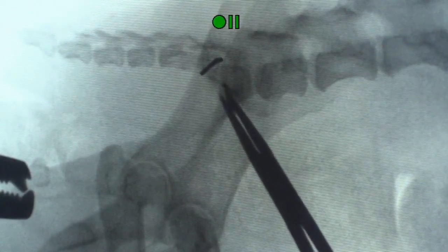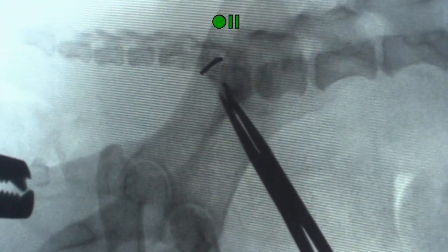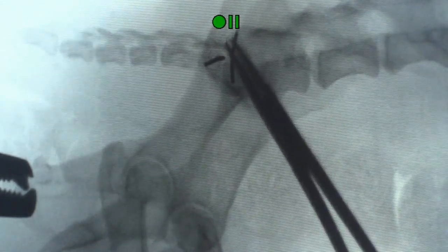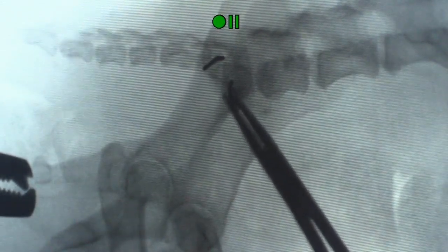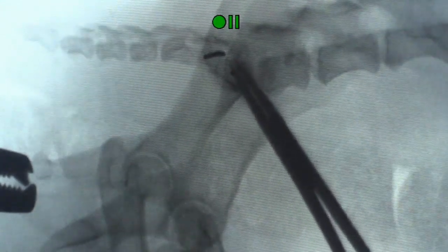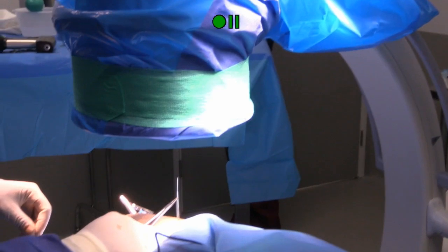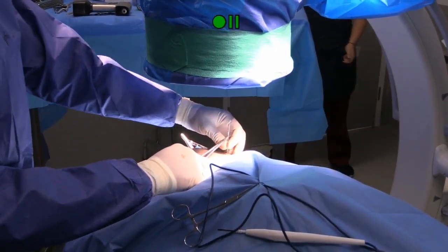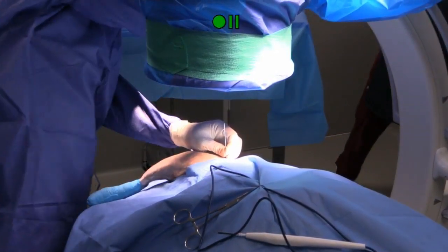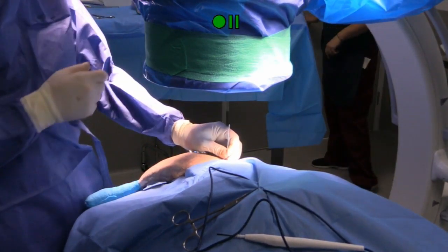So this pin that I'm putting in, as Charles has suggested, I'm going to use as a guide pin for my drill, ultimately. So I'm just making sure this one's bang on where I want it to go. So that looks just about perfect. Just see what James is doing down here on the patient. So just repeatedly fluoroing and moving that pin position around until he gets it exactly in the right spot.